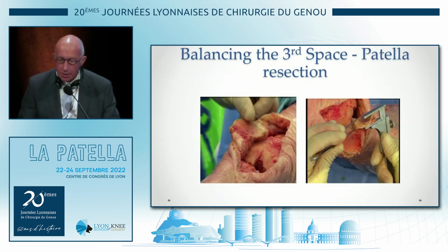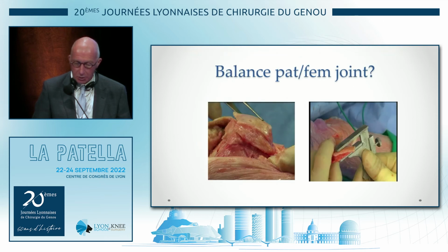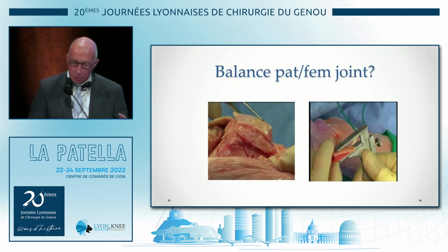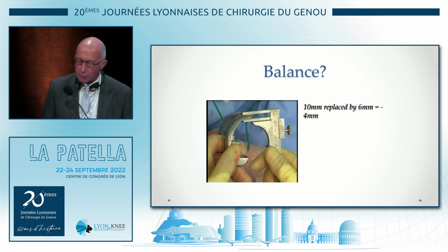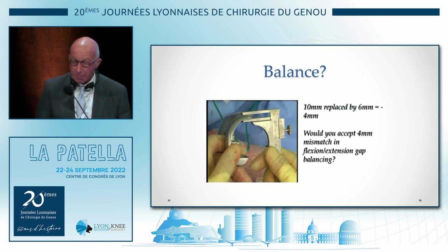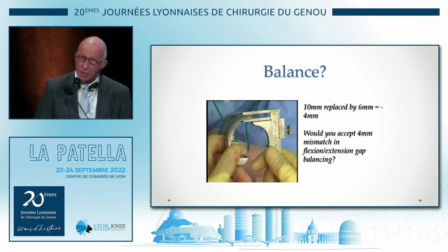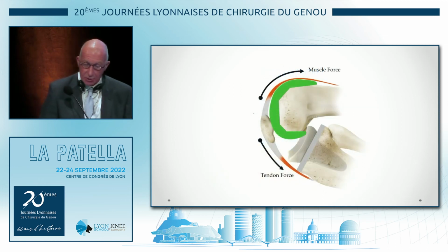And then finally, the patella resection. We've talked about how we measure the patella resection to make sure the polyethylene is correct, but actually we never really look at the trochlear resection and how much we take away. And the whole idea would be to balance this joint. Okay, so we've talked about how sometimes you take away 10 millimeters of bone and replace it by 6 millimeters of metal, so that's an understuffing of 4 millimeters. And we certainly wouldn't accept that in balancing the flexion and extension joint.